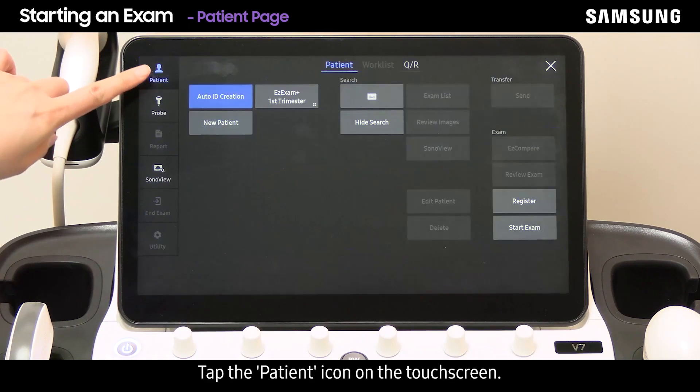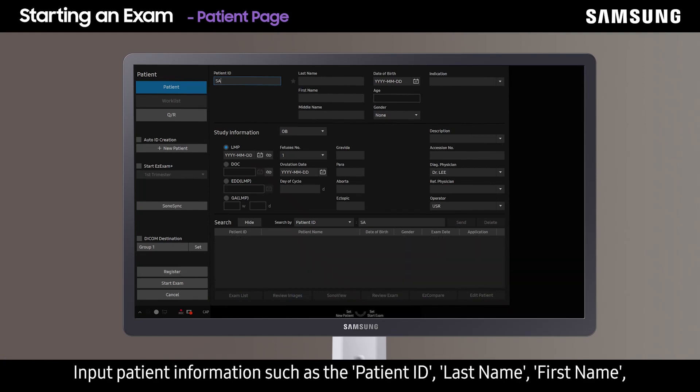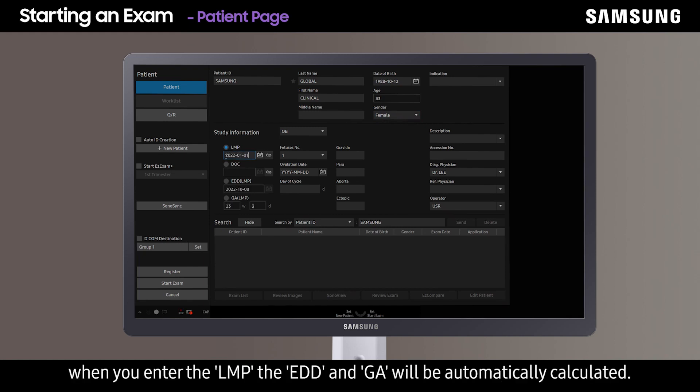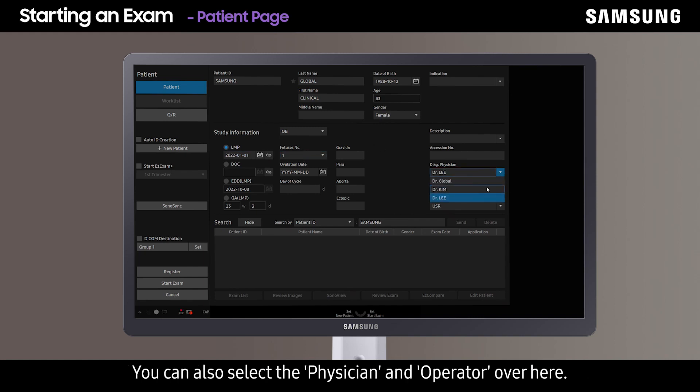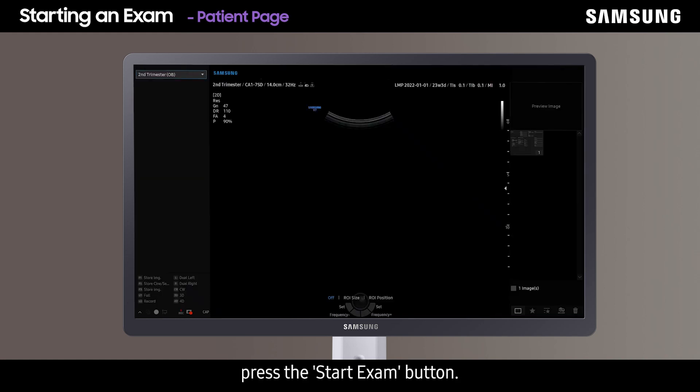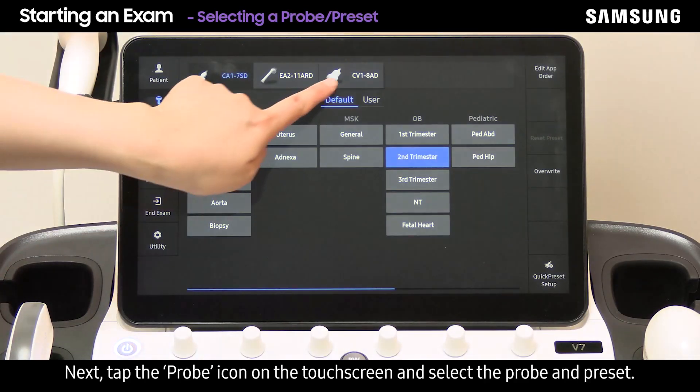Tap the patient icon on the touch screen and input patient information such as patient ID, last name, first name, date of birth, and gender. In the OB study information tab, when you enter the LMP, the EDD and GA will be automatically calculated. You can also select the physician and operator. Once all the necessary information is inserted, press the start exam button. Then tap the probe icon on the touch screen and select the probe and preset.